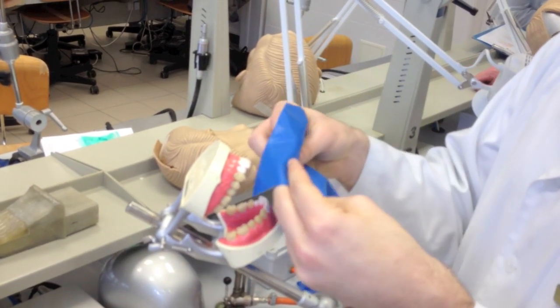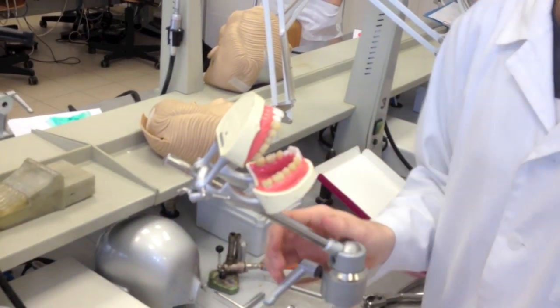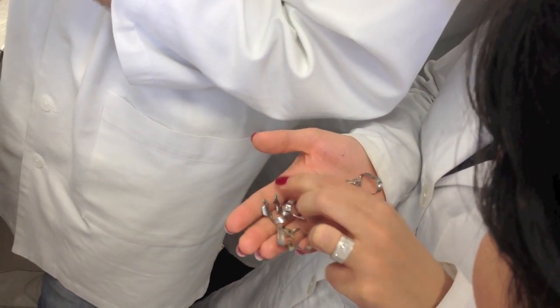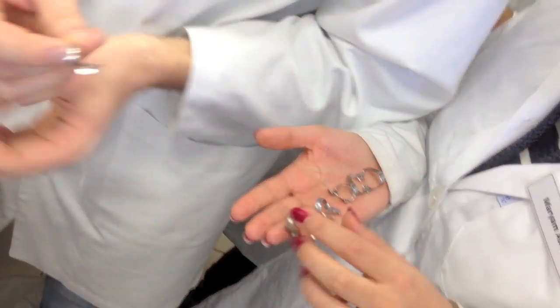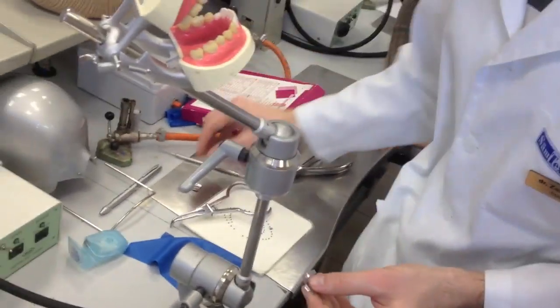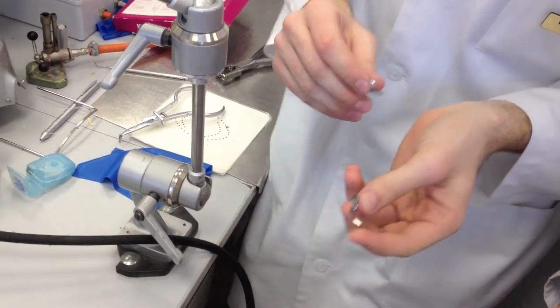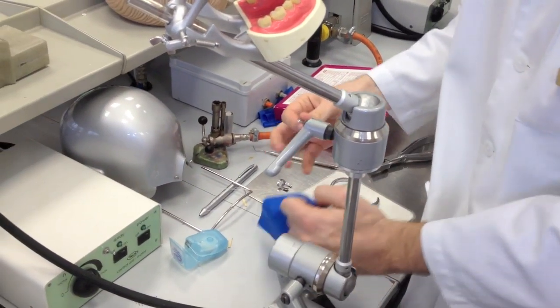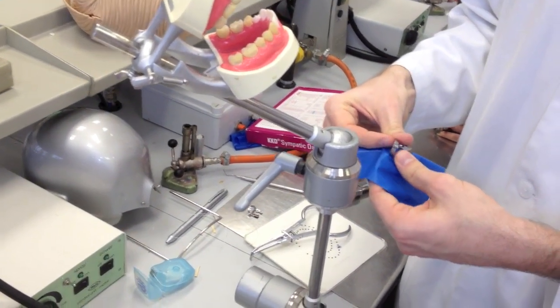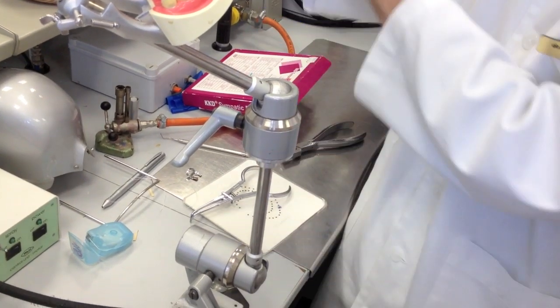Option number one: place the rubber then the clamp. Option number two: place the clamp together with the rubber. This is a molar clamp with wings — here is the difference between winged and wingless. If you have a winged clamp, first try it on, and after that you use the wings to fix the rubber on the clamp, like this. The assistant helps you — you have to be careful to keep the rubber away from both mesial and distal, just to be sure that the clamp fits on the tooth and not on the rubber.